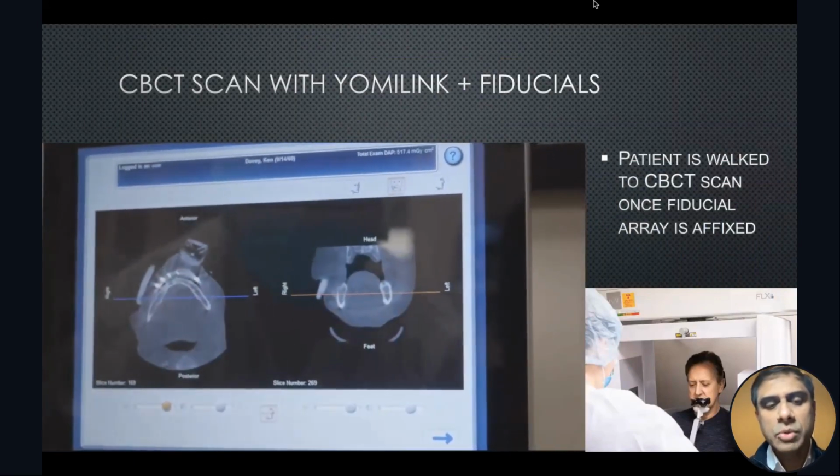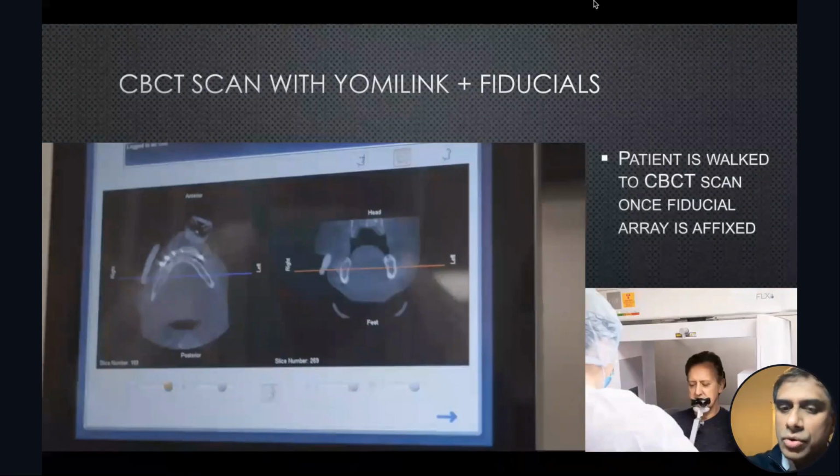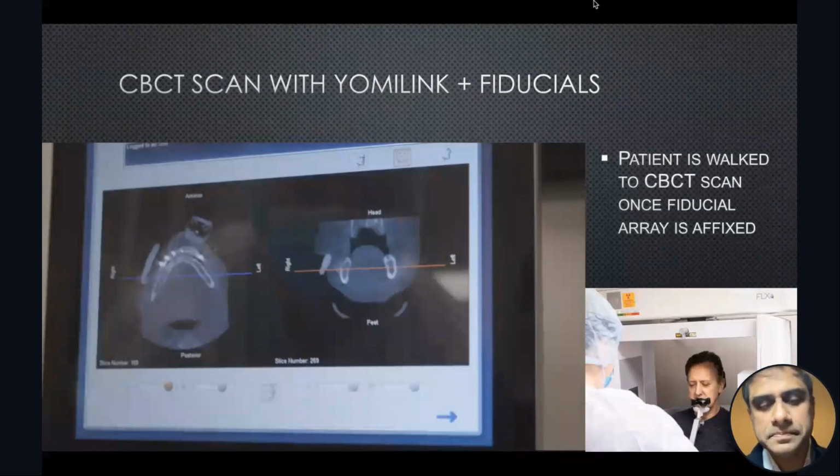Once the CBCT is recorded, you take the DICOM file and transfer it into the treatment plan software. And let me be honest, the second generation treatment plan software has become so much easier because I told them one thing: listen, we are not computer engineers. We're not going to navigate through multiple clicks. It has to be easy. Just press a couple of buttons there. Of course, now they're touch screen, so you just press on the touch screen and go right to where you want to go, versus navigating through multiple categories of software or windows. Next slide, please.